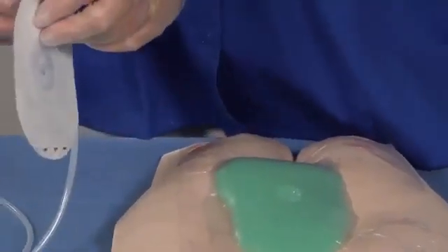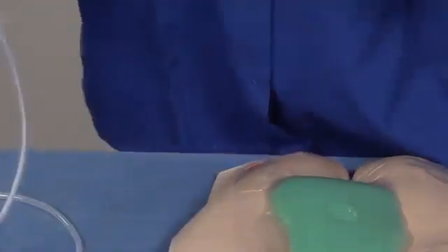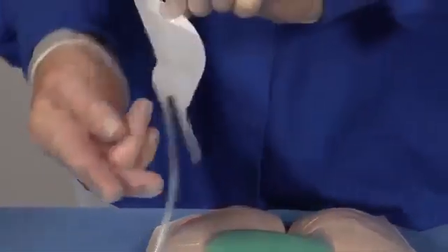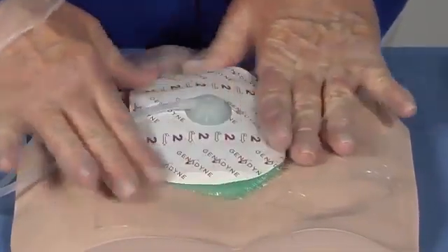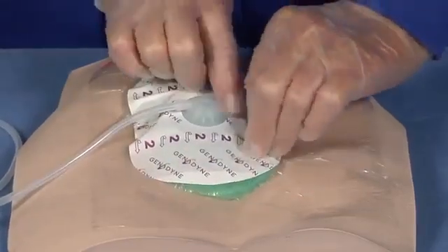Remove the number 1 backing from the port dressing and place over the opening on the transparent film that you just created. Remove the number 2 backing and lastly, remove the side tabs.